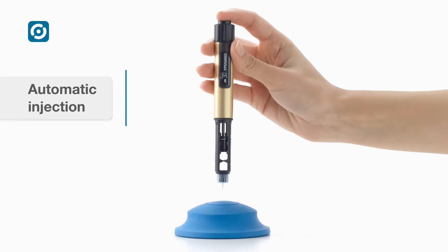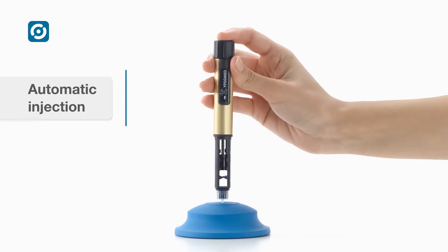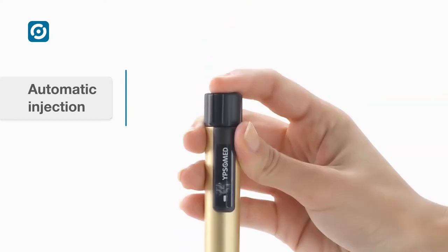ServoPen has a short stroke distance independent of the selected dose. The injection is performed by gently pushing and maintaining pressure on the injection button.